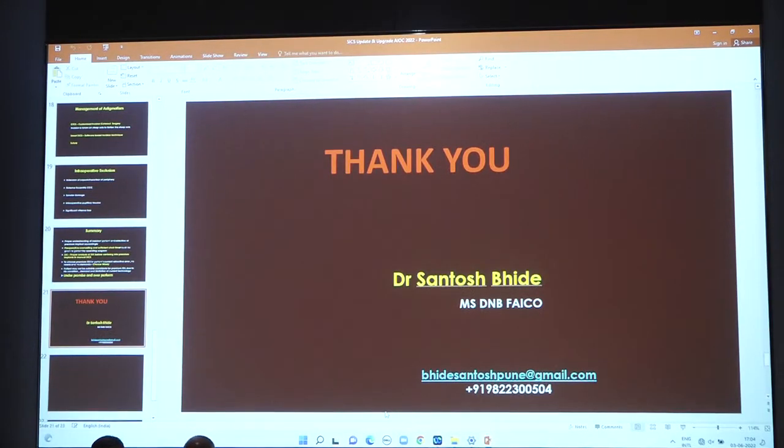I think Santosh has shown you that yes, premium IOL is possible in SICS.